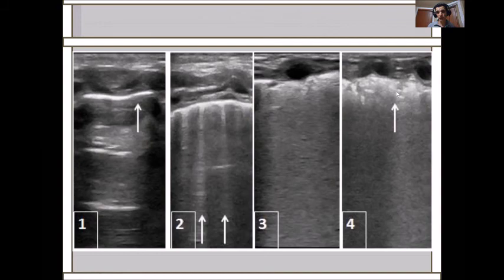What about this? Pneumonia. There is air bronchogram. Well, remember the history. There's a very small area, can be pneumonia or subpleural consolidation. So if this is a baby on long-term ventilation, this can be chronic lung disease. But if this baby has fever and presents acutely at 2 years old, this is pneumonia. Okay, but it's definitely not bronchiolitis. Okay?